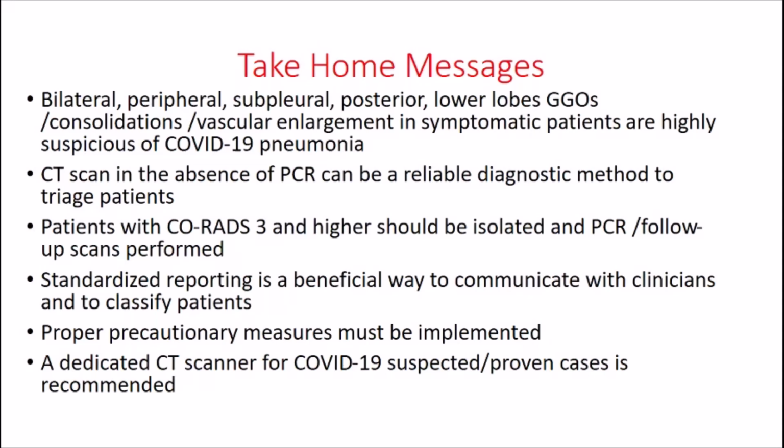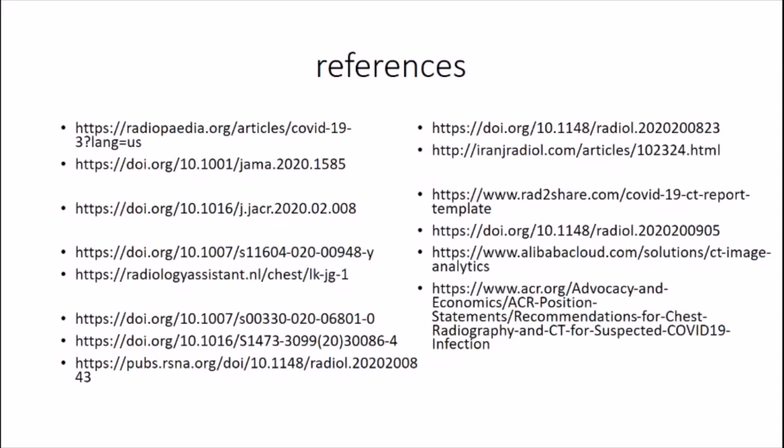Standardized reporting is a beneficial way to communicate with clinicians and to classify the patients. Proper precautionary measures must be implemented, as I have mentioned at the beginning of this lecture. And this is something that I recommend, that we should have dedicated CT scanners for COVID-19 suspected or proven cases, because in our situation in Libya, I don't think we have the advantage of not using CT efficiently.